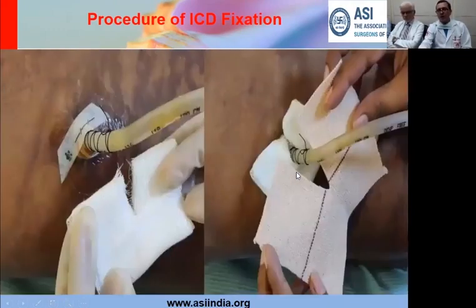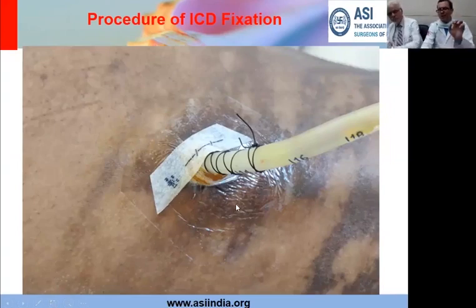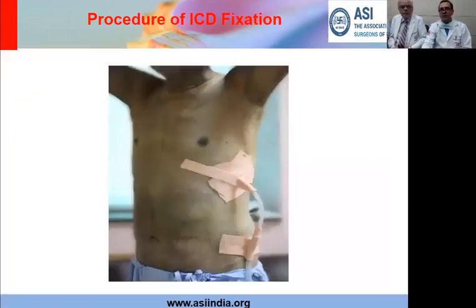But it's important that you have an initial covering of a sterile dressing, so that this area is now going to remain sterile as long as this dressing is in place. It's a small but I think important step. And then we have the gauze piece and the plaster.